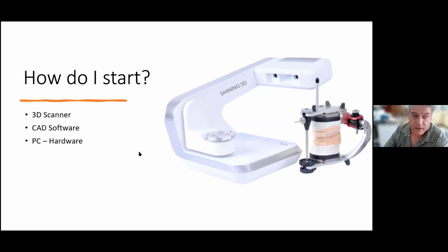Don't go for Ryzen, or Ryzen can work. The AMD Ryzen processors work now from the last year's version on. But if you look at graphics cards, please stick with NVIDIA. And of course, you need an internet connection because you need updates. You need to send files somewhere, or you have to receive files.